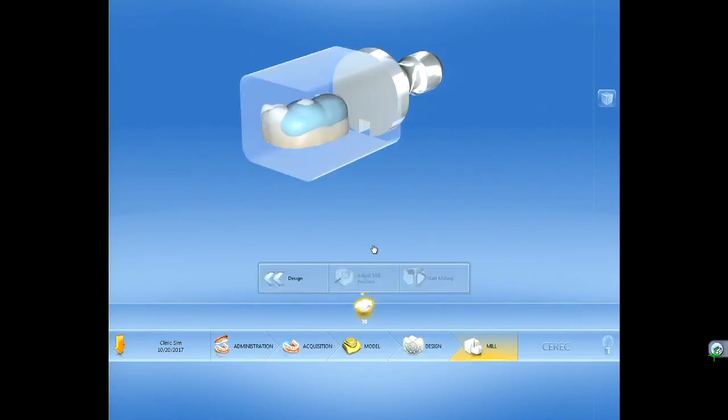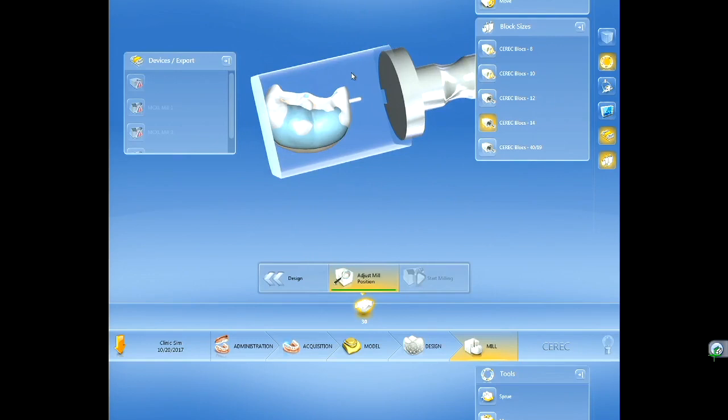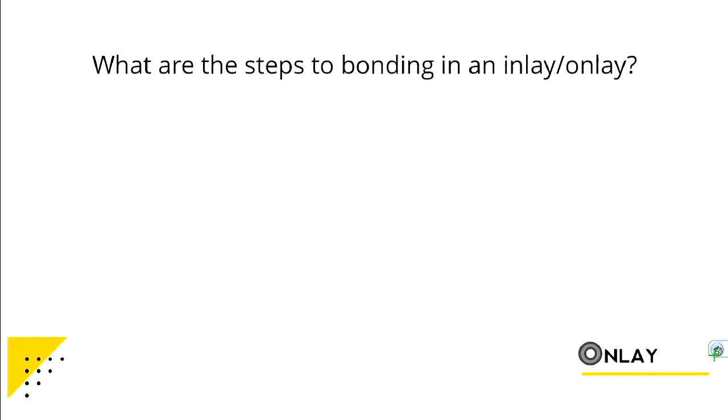Once you think the design is good, go to your mill step. It will ask you to insert the block — we'll give you a CEREC block 14. Insert that and screw it into the milling unit just like you did with your Emax. These take about 15 minutes or less to mill. The important things to remember: trim model, and then play around with the tools. Work pretty independently through this; we'll have some people up at the front if you need help.